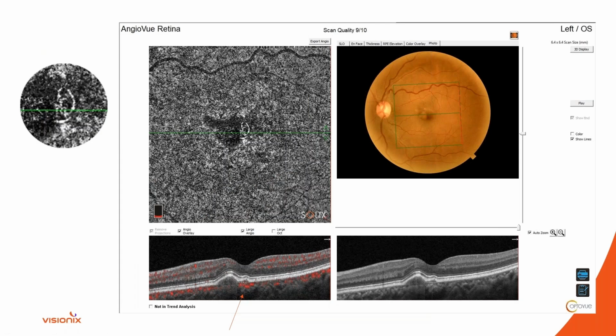And I went and got angiography, and it's really subtle, but this patient had this little baby membrane right there, and I magnified it to show you over there. And here's my little increased area of pixelation. So pay attention to these things. If you had this patient, and you weren't 100% sure and you got the B scan and it looks like a drusenoid PED, have a nice day, you would have missed something.